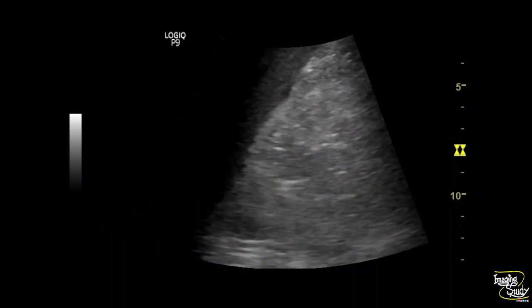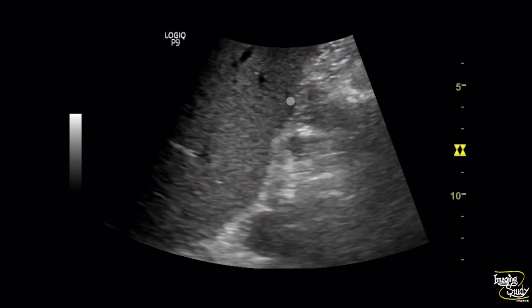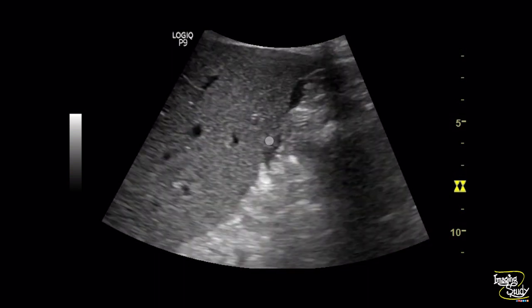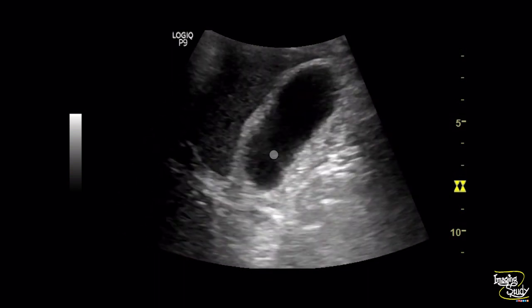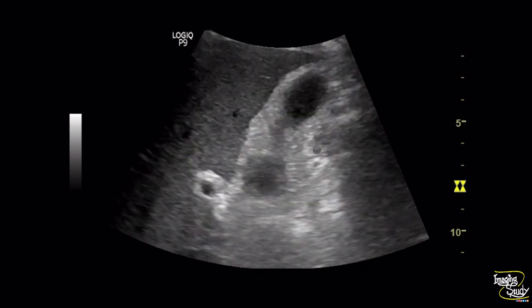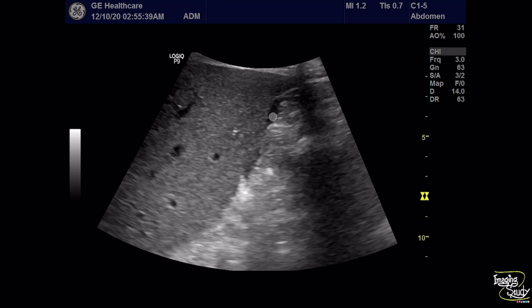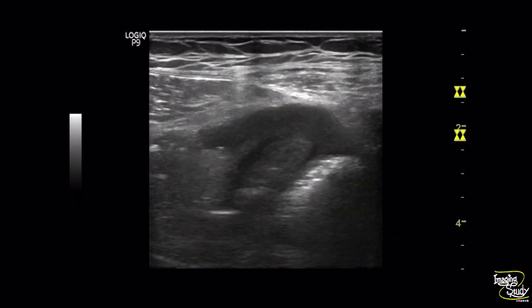In favor of cholecystitis, we have seen some pericholecystic collection as an anechoic area adjacent to the gallbladder. This is a small amount of collection noted adjacent to the gallbladder fossa — that is pericholecystic collection. Now, the bigger diagnosis will sometimes confuse you. We have already diagnosed this patient with acute cholecystitis based on these features.